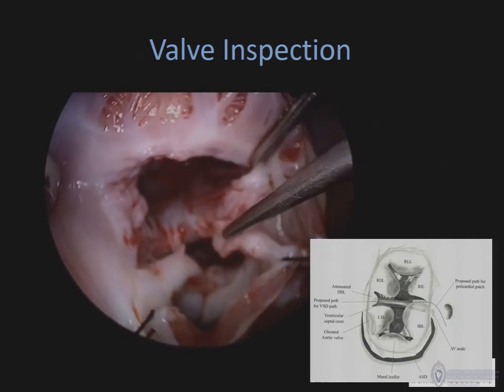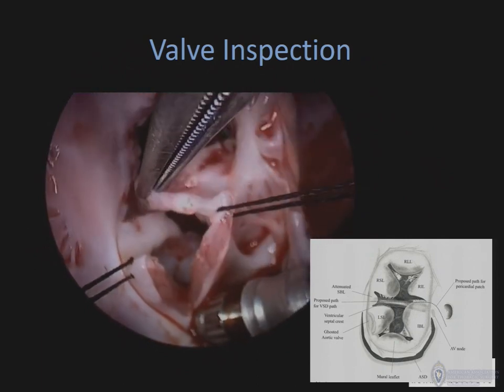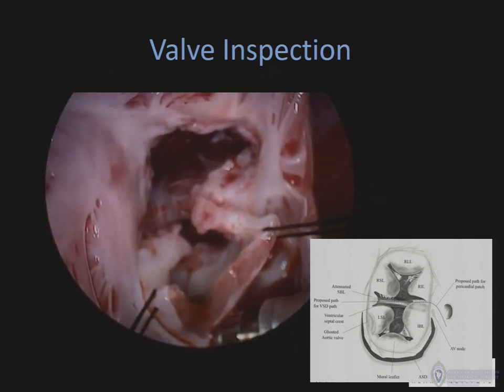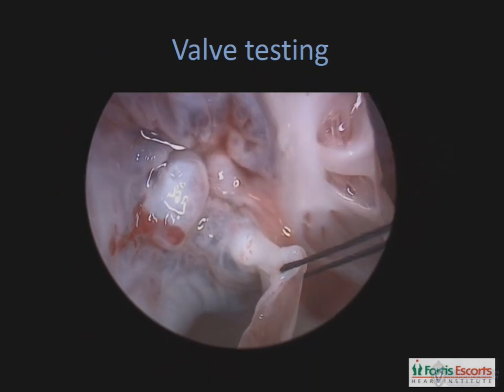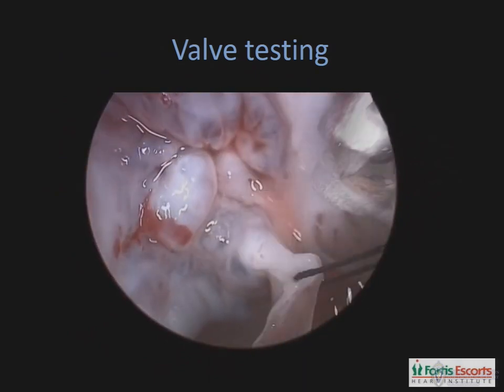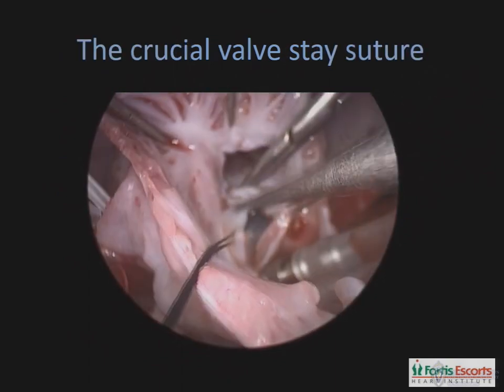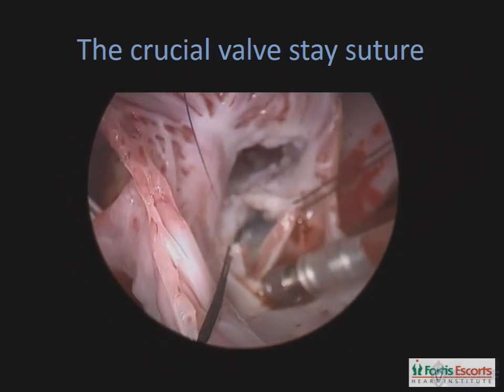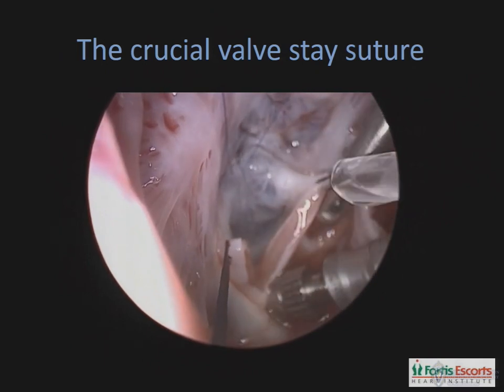The next step is a very diligent assessment of the common AV valve. In this situation, this is a Rastelli type A common AV canal defect, and you can see assessment of the chordal attachments. Next, we fill up the ventricular chamber with saline and assess the floating of the bridging leaflets, and assess exactly where the single stitch marking the center point of the line of separation between the mitral and the tricuspid components should be placed — just above the level of the ventricular septal crest.